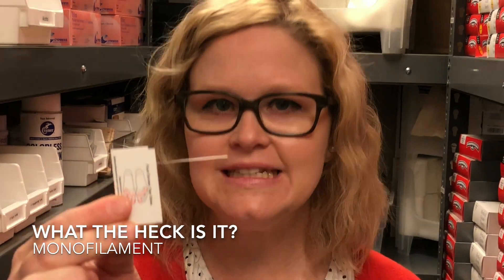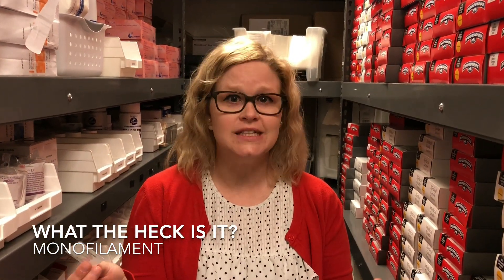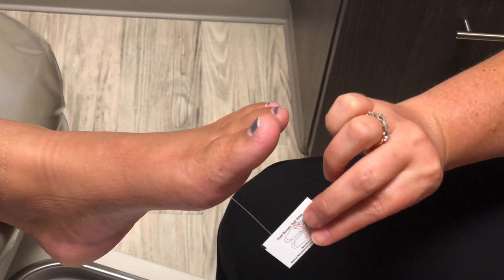This is a Semmes-Weinstein monofilament. You're like, Doc, what do I even do with this? We use this to test for peripheral neuropathy. It doesn't hurt — as you can see, it's almost like fishing wire. It's a 5.07 monofilament.